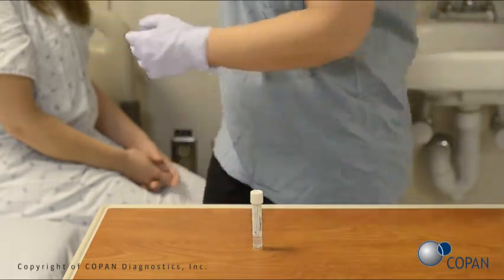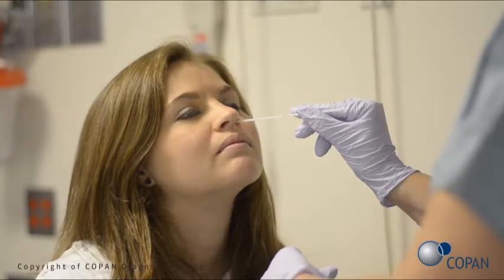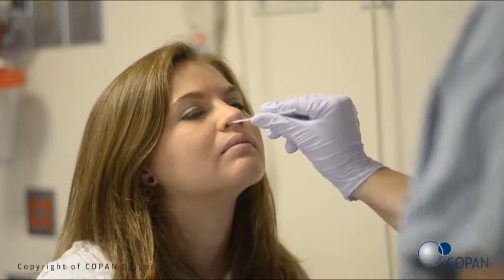Place the white swab into one of the patient's nostrils. Rotate five times, pressing lightly against the inside of the nose to collect the nasal sample. Repeat the process in the second nostril with the same white swab.